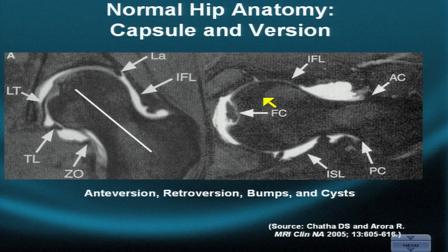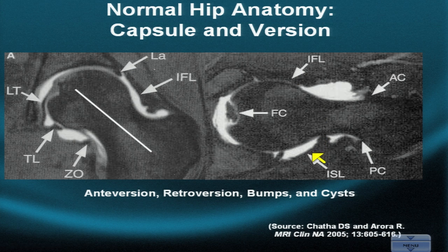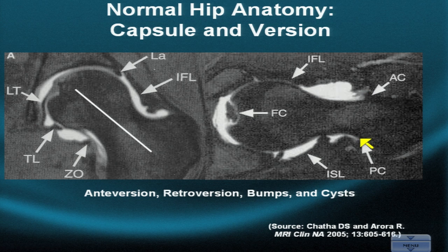The para axial is used to evaluate the shape of the femoral head and the tapering of the femoral neck. Lack of tapering may imply the diagnosis of cam-type impingement — this is where we look for bumps and cysts. The para axial also shows the iliofemoral ligament anteriorly, the ischiofemoral ligament posteriorly, the fovea capitis with fat, the ligamentum teres, and the anterior and posterior capsule.